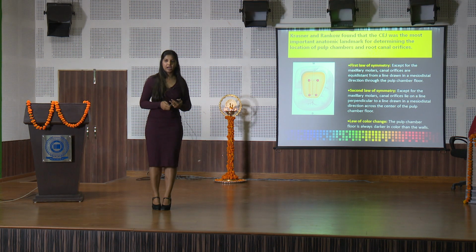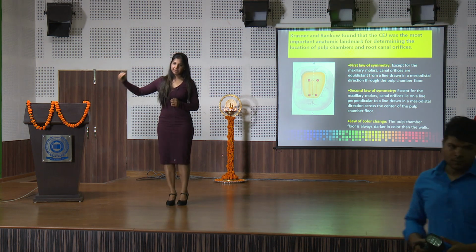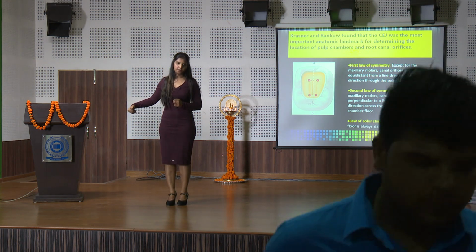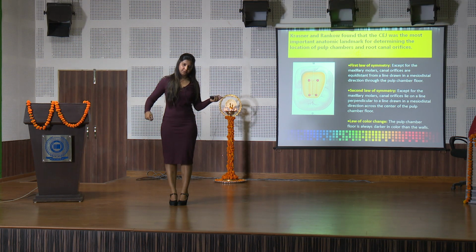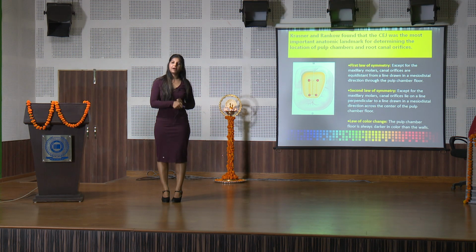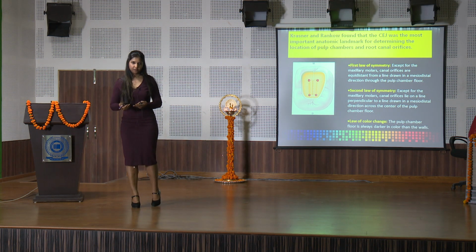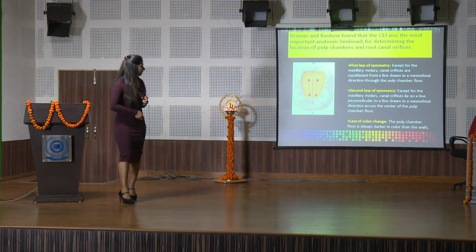Often interns will come to us and they'll ask us, "Ma'am, is there one canal or two? Please check and tell us." You can do it yourself. How? If you can find 2 canals on the mesial side, mesiobuccal and mesiolingual, look at the opposite side. In that center line, which is dividing the pulp chamber mesiodistally, if you find a canal on the distal side on that particular line, that means there is only one canal. If it is either buccal or lingual to that particular line, that means there has to be another canal. So please extend your cavity to find that other canal. Got it?